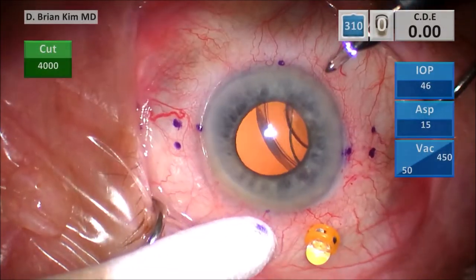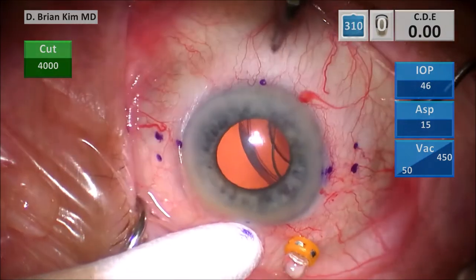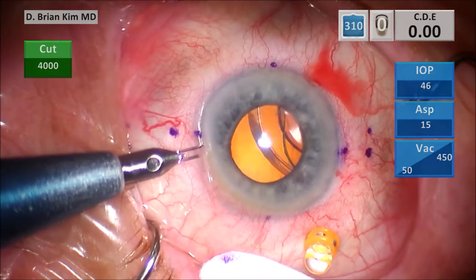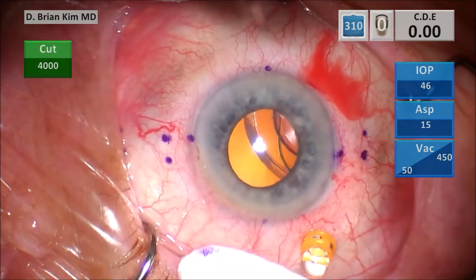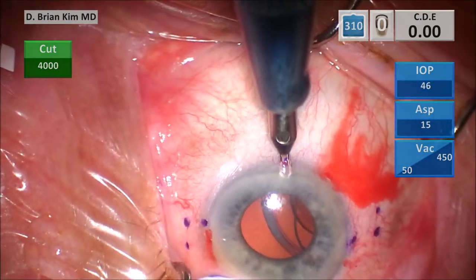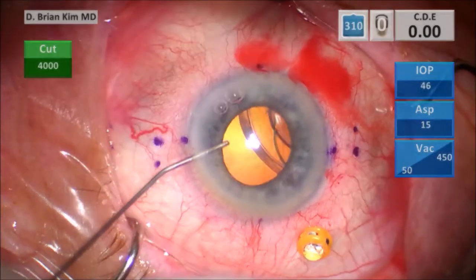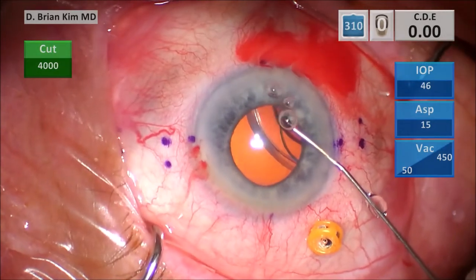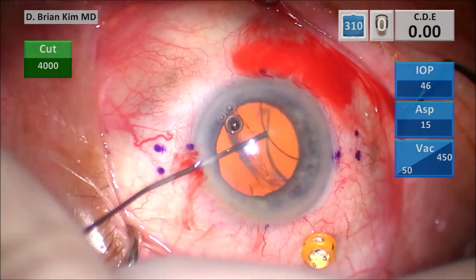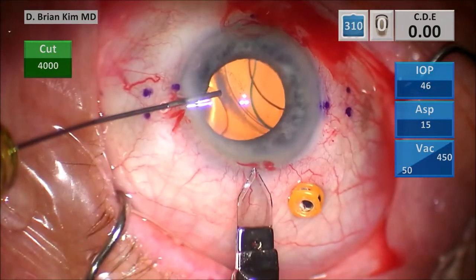I'm making my paracentesis incisions for lens removal, as well as for the AC maintainer and the contralateral incision to externalize a leading haptic. This is intracameral lidocaine and then some intracameral epinephrine. You can see the lens is wobbling a little bit, then some dispersive viscoelastic to coat the corneal endothelium. This is the three-millimeter keratome blade — I make a vertical groove and then enter.